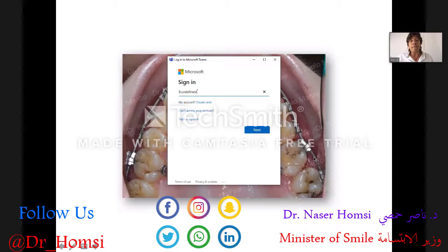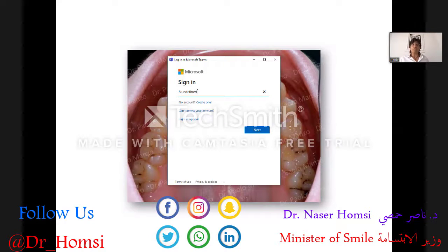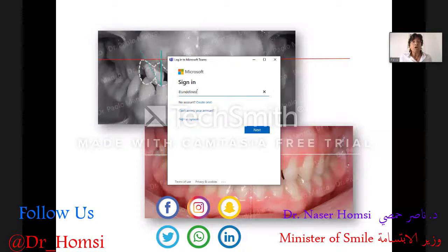Going on, we can bond also the second molar to compensate the rotation of the first molar. We go on with the wire in order to correct also the rotation of the molar, and now we are ready to debond. We debonded these brackets, and also now we moved from this clinical intraoral situation. We planned something like this to manage leveling also of the gingival margin. So the settling of the margin on the anterior is very important.